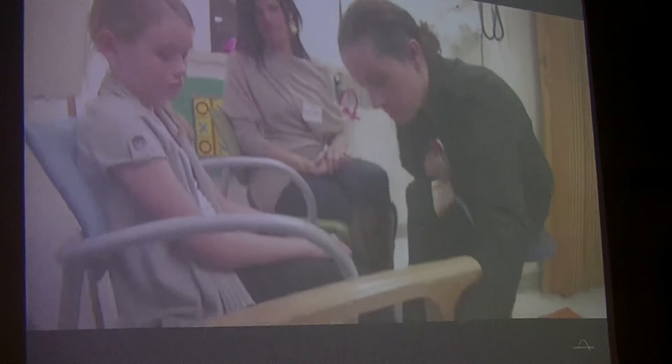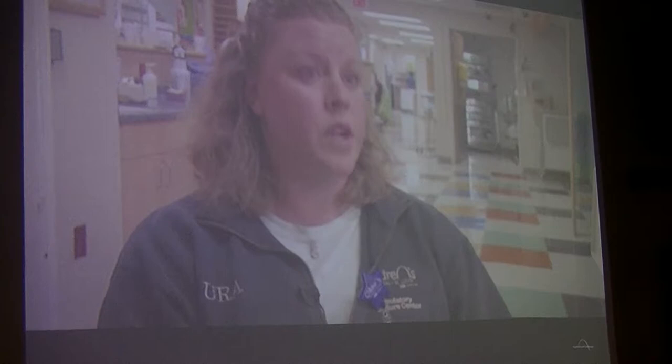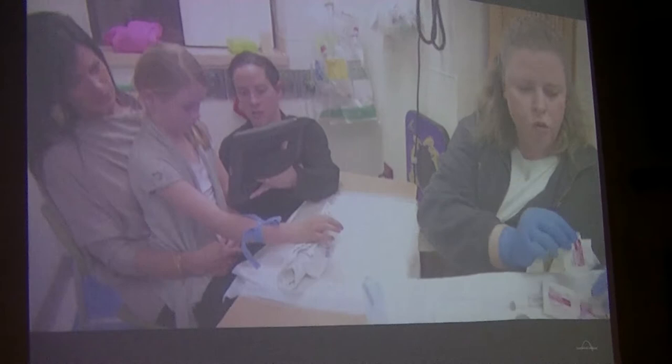It's really important that the parents just stay really calm and act like this isn't a big deal. The parents come through the door nervous. The children come through the door nervous. IVs are intimidating for kids because nobody really likes needles. Everyone's afraid of needles, even adults. So we've tried to come up with a way so it's less intimidating and less painful. This is our jeweled washcloth, okay?